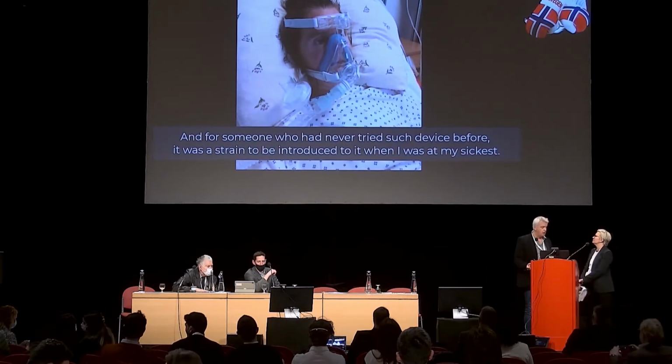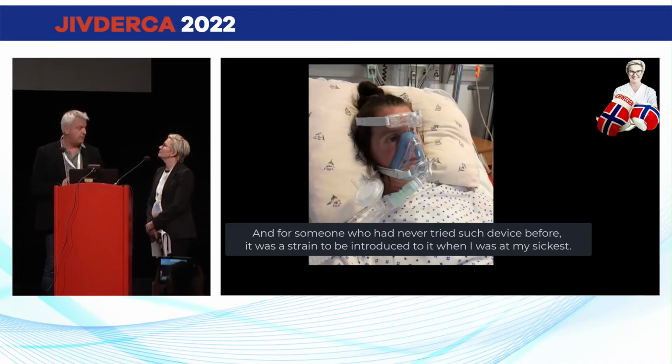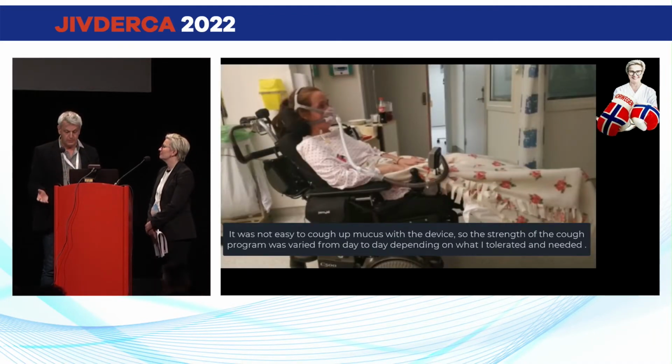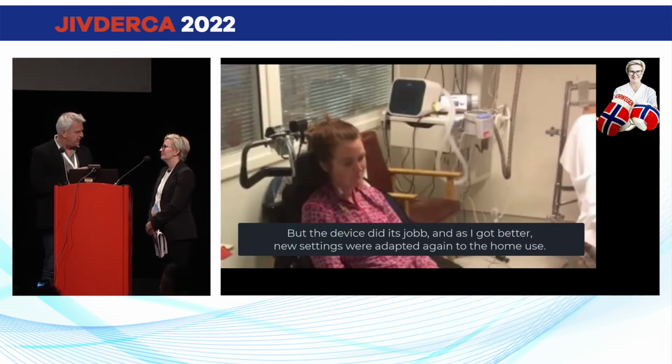So finally, upper airway visualization during MIE is only useful to conduct studies. I wonder. Come on, there is no need to do it in the clinics. In the clinics, I mean. Okay, studies, clinics. Do you see the difference? Have you seen patients finding it useful for themselves?